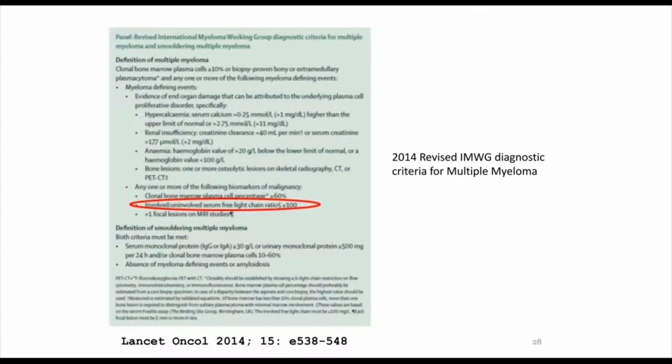More recently, in 2014, the IMWG revised its diagnostic criteria for multiple myeloma to include kappa-lambda ratio of greater than 100 as a myeloma-defining event. This again underscores the importance of free light chain quantitation and kappa to lambda ratios in the diagnosis and monitoring of multiple myeloma.